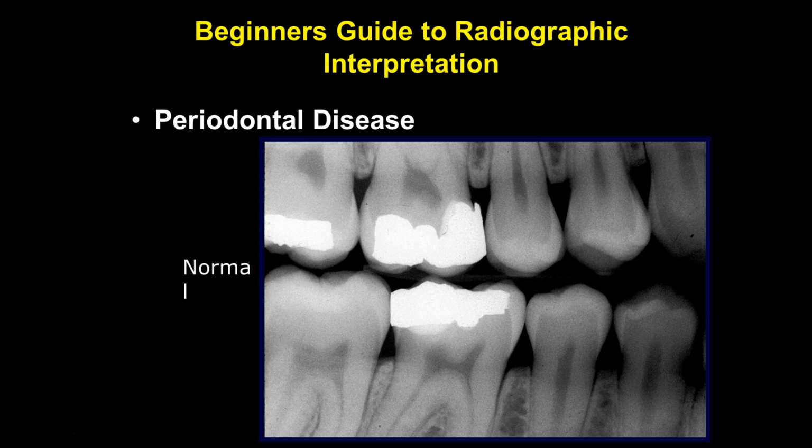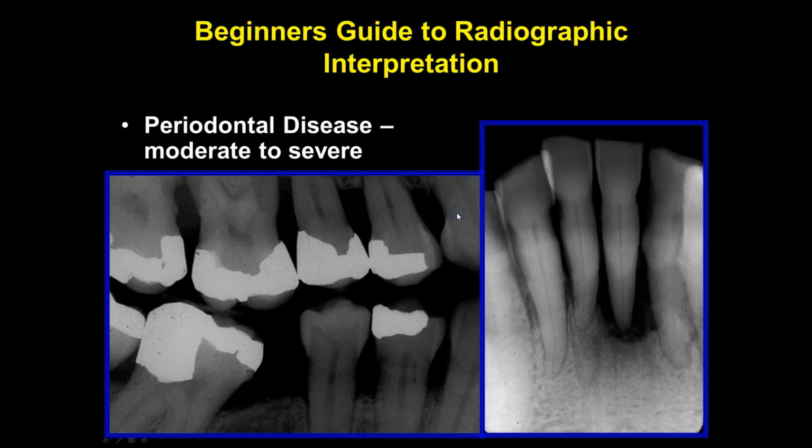What is normal periodontal structures? We're looking here. We have some nice horizontal bone that's present following the CEJ. The one thing that pops out to me on this image is this wonderful overhang right here. This patient's going to wind up with some serious issues if this is not remedied, or at least they take an active interest in keeping this area clean, because it will wind up harboring bacteria and collecting and destroying the bone matrix here.